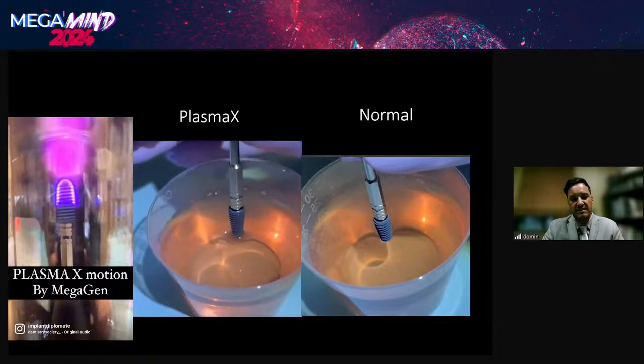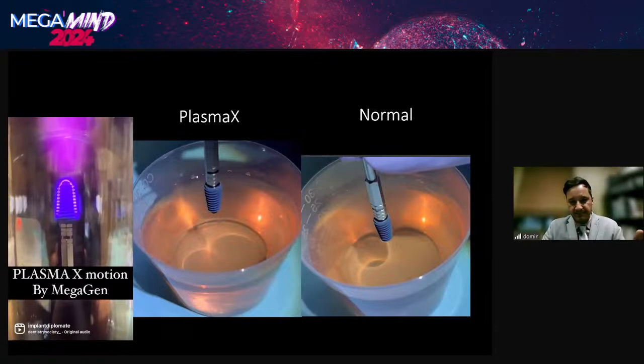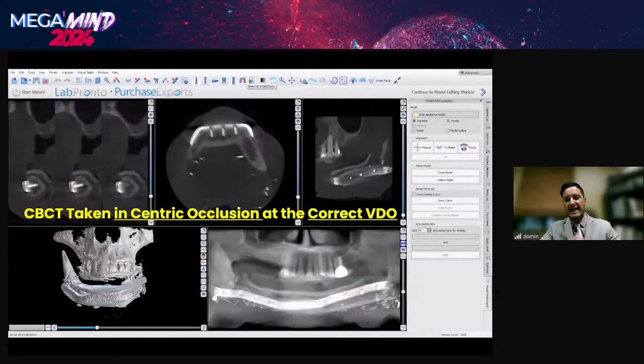And all that is giving the implant plasma coating. That's all we've done, right? And so that plasma removes the hydrocarbons, increases the wettability, so you can get implants to integrate as fast as possible. And in cases like this, you need it.